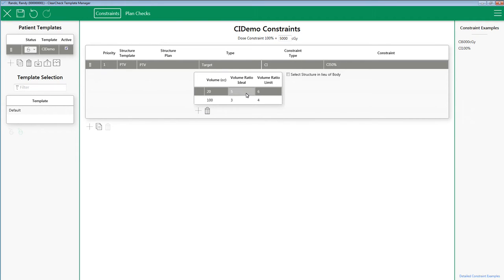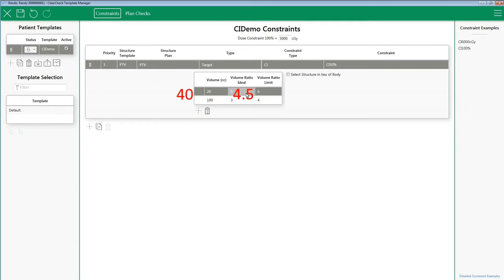Here's how the table works. If I have a target volume of 40 CC, that is in between my 20 CC and 100 CC volume values. This means a linear interpolation will take place. My ideal would be 4.5 and my limit ratio would be 5.5 because of the linear interpolation.